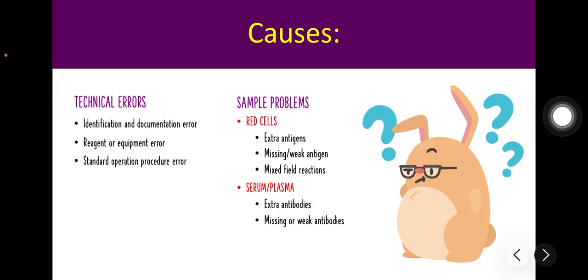As for the order of addition, we are taught to always add clear solutions, the serum or the reagents, first and the red cells second, to visually confirm that both components are in the tube. Then there is inadequate resuspension. If the button of red cells at the bottom of the tube is not completely dislodged and shaken gently before grading, the reaction may be misinterpreted.